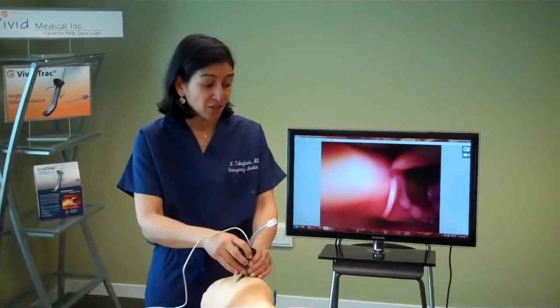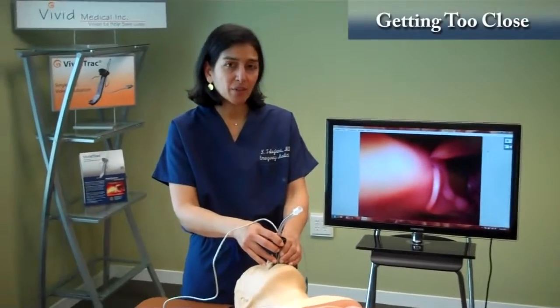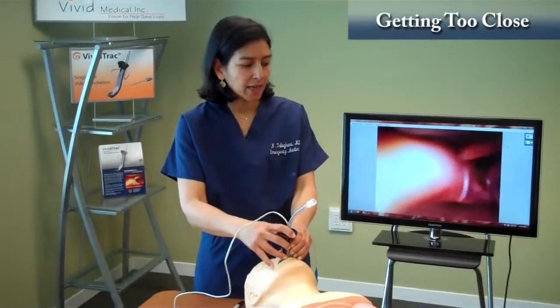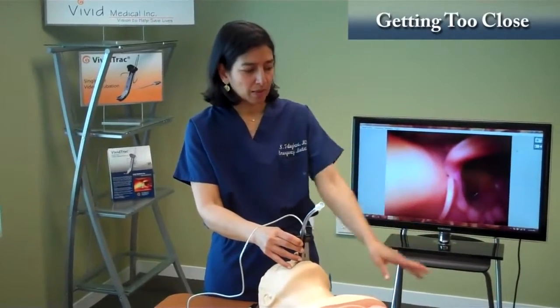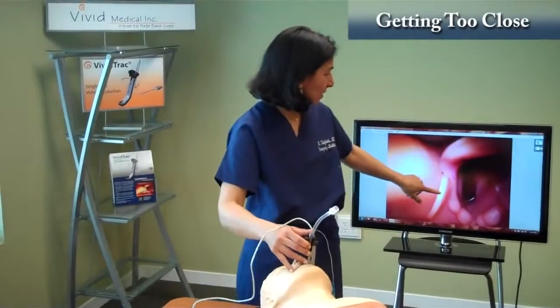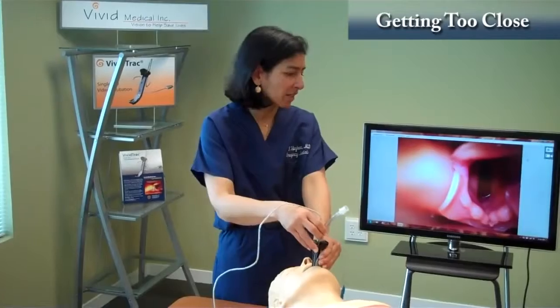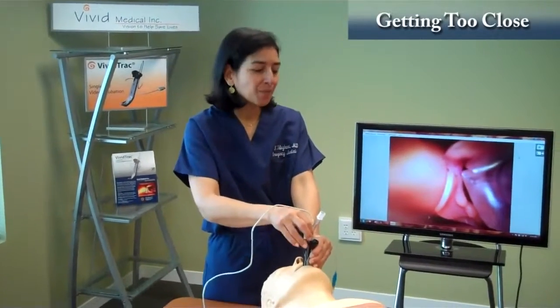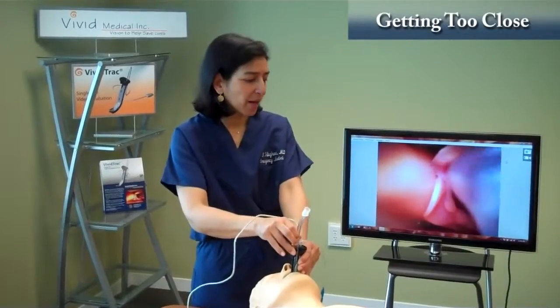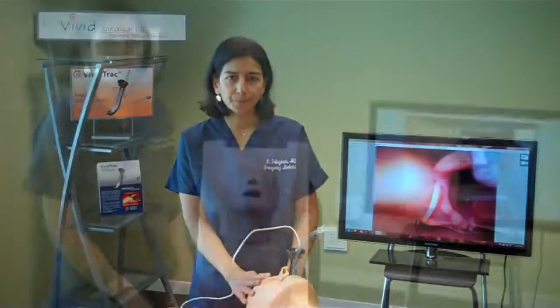One of the pitfalls I just did, as I was showing you, is I got too close. If you get too close, it's going to be difficult to intubate. So you do want to stay at the recommended distance, which is you want to be able to see the epiglottis and you want to be able to see the cords. One of our desires is to get really close as we see it, and what that's going to do is that it's going to sometimes, although not in this case because it's such a good device, but it will sometimes create a blockage in your view from where your cord is if you are too close.